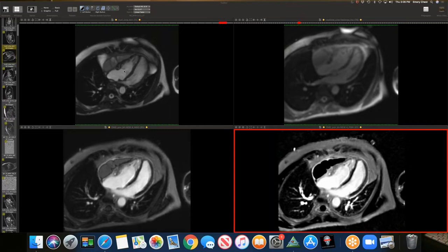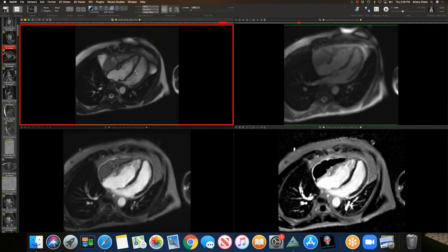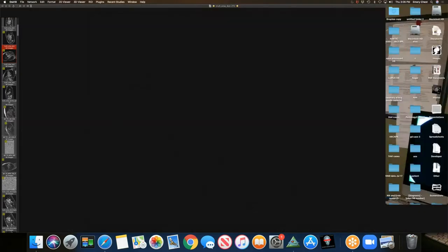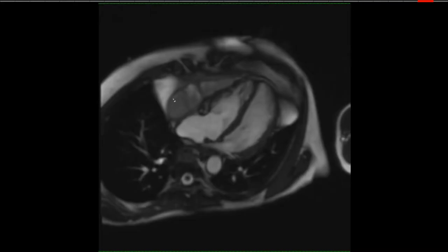I'll present a few cardiac cases today. The first one is a cardiac MRI for medication was pericarditis, and we'll take a look at the image on the top left first. That's the SSFP, and the first thing that draws attention is this complex collection here, which looks like it's in the pericardial space.